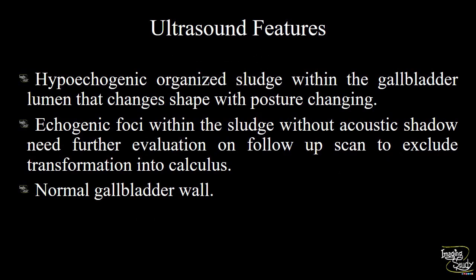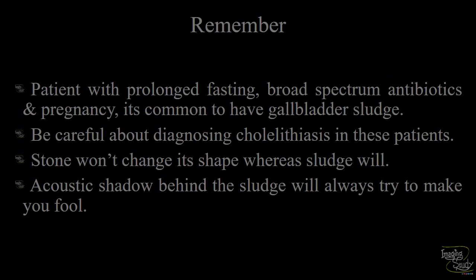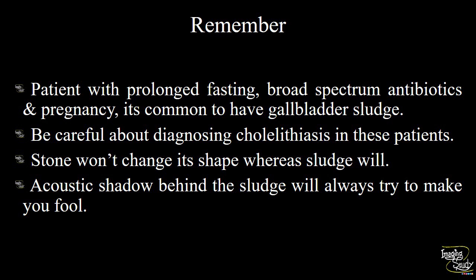In summary: a hypoechoic organized sludge within the gallbladder lumen that changes shape with posture change. Echogenic foci within the sludge without posterior acoustic shadows need further evaluation on follow-up scan to exclude transformation into stones. The gallbladder wall looks normal, which excludes cholecystitis.